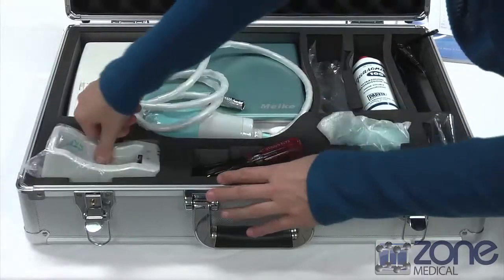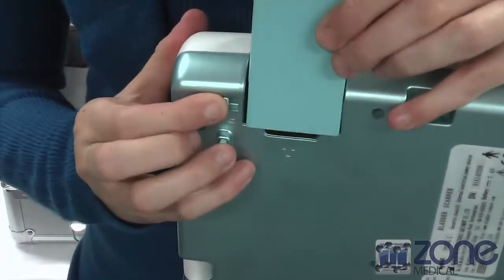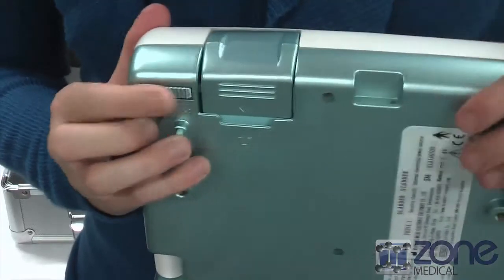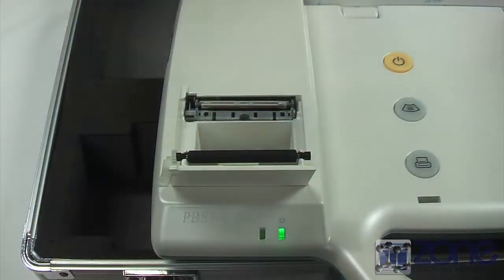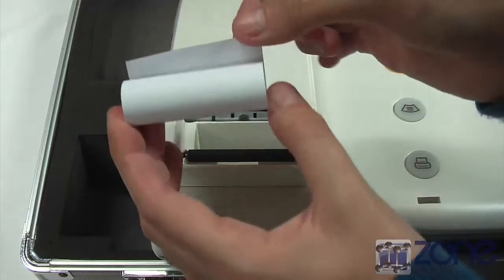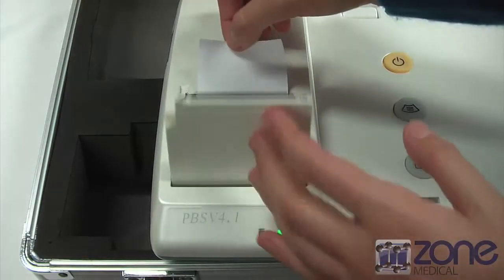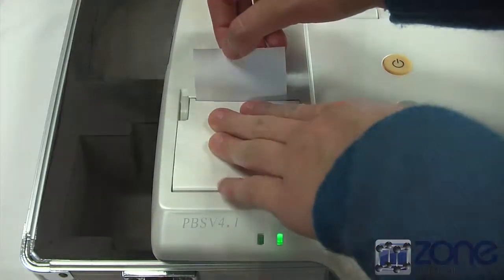For the initial setup you will need to insert the battery. To do this, open the lock on the battery compartment on the back of the device and insert the battery so that the arrow points towards the device. To set the printer up, open the printer roll compartment and put the roll so that the end comes out of the device. You are now ready to print and ready for a test.